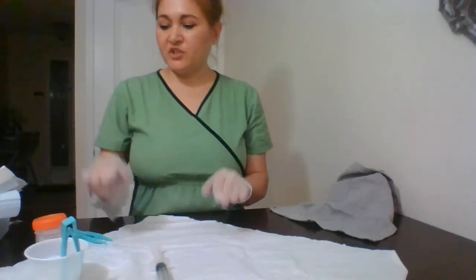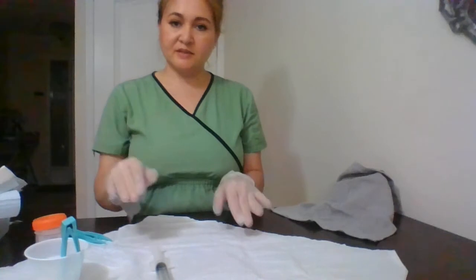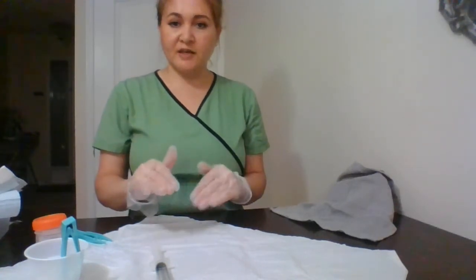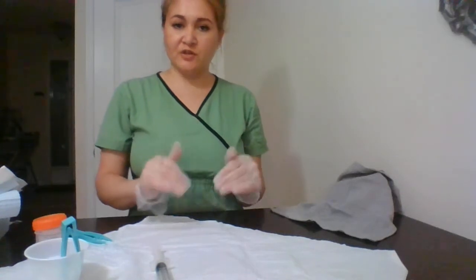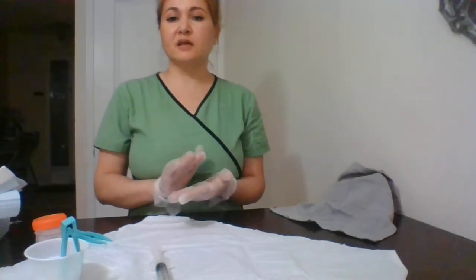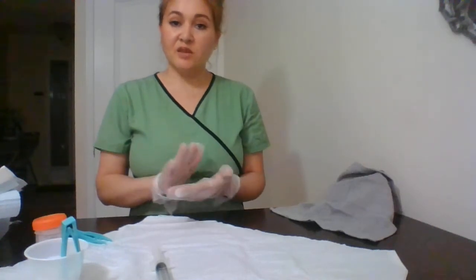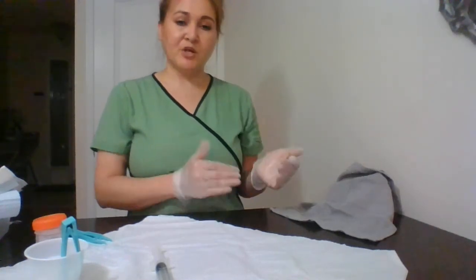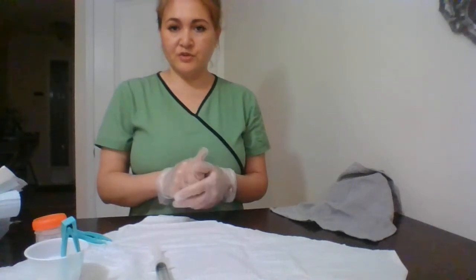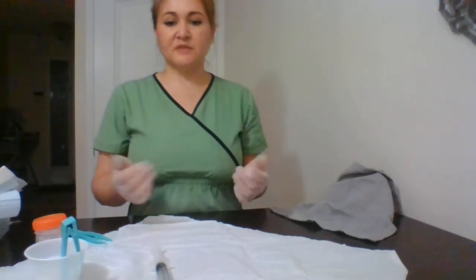But what I wanted to mention is the urine that I've collected in the graduated cylinder. I will have to chart that, record it in the patient's chart. I will have to check for the clarity of the urine, the color of the urine, the volume, how much my patient has voided, and also for any strong odors, and that's about it.